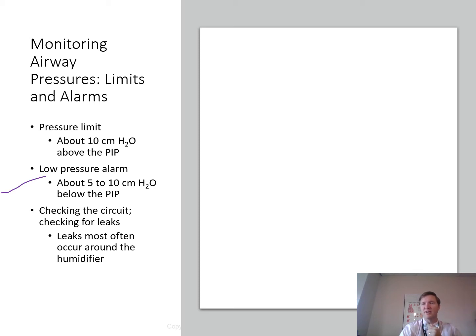So a humidifier could be another source of the leak, right? It could be cracked, things like that. So that's something to look at. If the alarm doesn't sound, and the humidifier is not the point we're looking at, then we're looking at the large bore expiratory line. We're looking at that, pinching and shutting that, and then the ventilator should be cycled. If the PIP alarm doesn't activate there, then the leak is located near the Y connector, right? So this technique works well for large leaks, but it's not very useful for very tiny, small leaks.